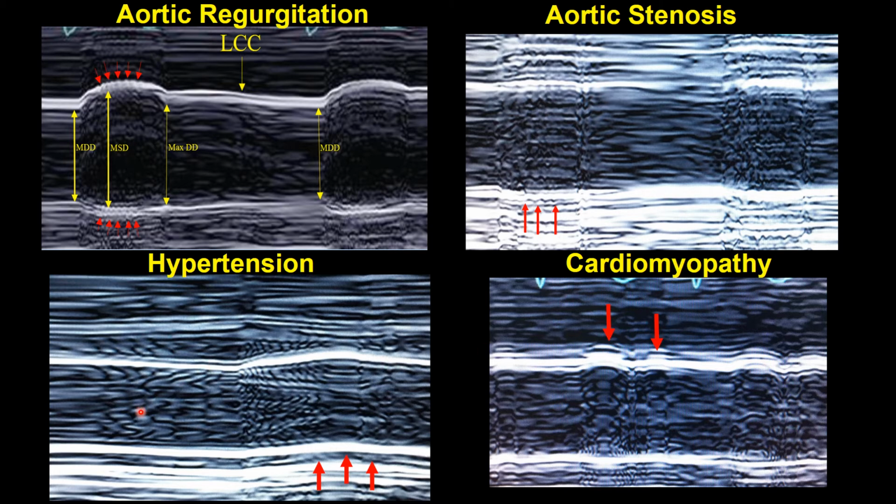Hypertension came as a huge surprise to us. It looks at first like there's paradoxical septal motion, paradoxical arterial wall motion, but that would be impossible. An artery can't get smaller in systole. So what we're seeing here is the patient has a blood pressure of 154 over 100, and the artery's just too stiff to pulse. So there's not much change in the diameter here.